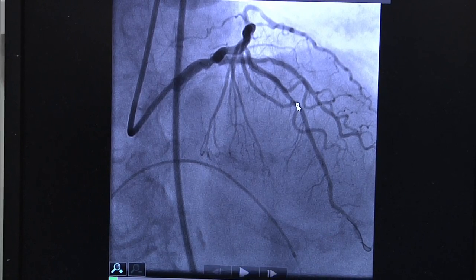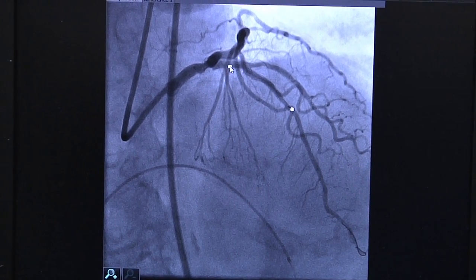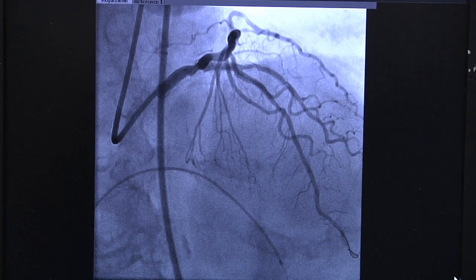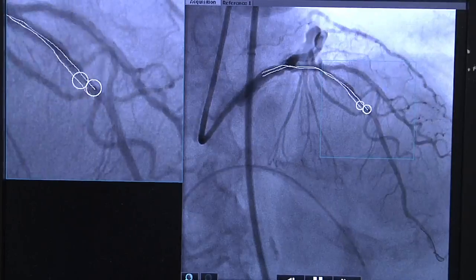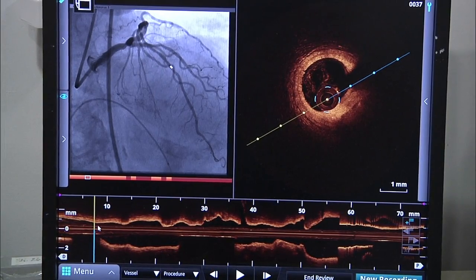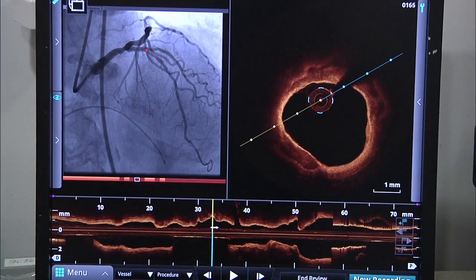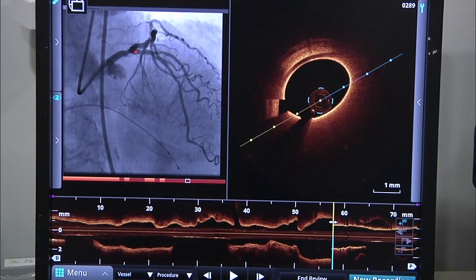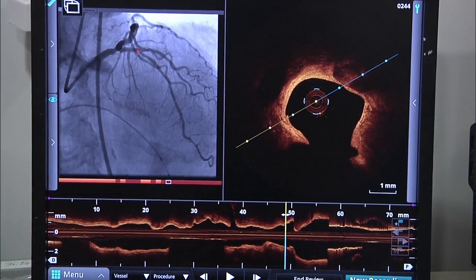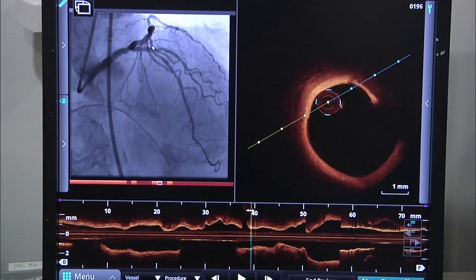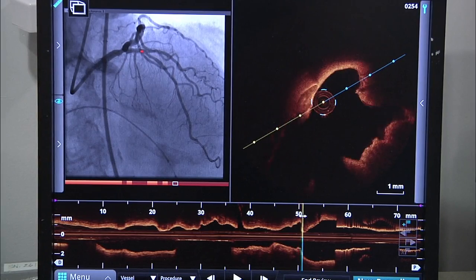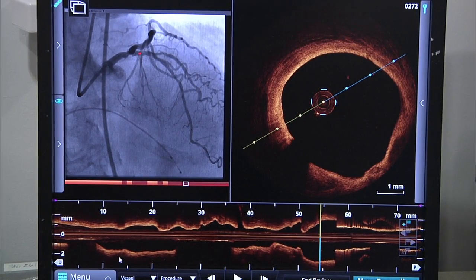Let's skip the co-registration and just show the OCT. We are coming to the distal left main now. If you see — this is the LAD — you can see the marker in the angiography. All of that bright signal is calcium, almost four quadrants. As you come to the distal left main, it is not a lot of calcium — more of fibrous tissue.